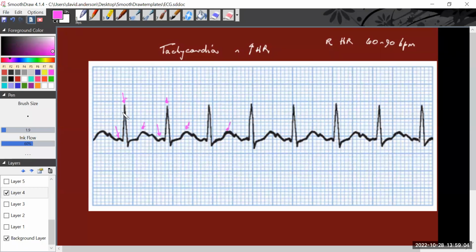Now you can see here, actually, the way I've drawn the way this particular tachycardia goes, let me show you something. When I look a little closely, here's our QRS. They're happening on a regular basis. So this is just a sinus issue. We don't have an interruption in the cardiac output, very likely here, unless it gets extremely fast.